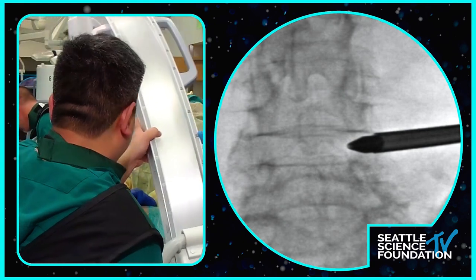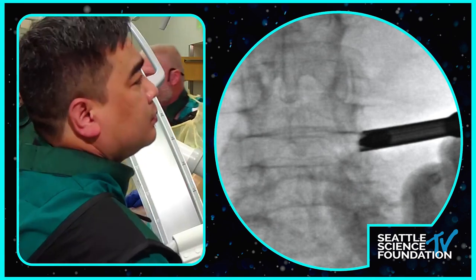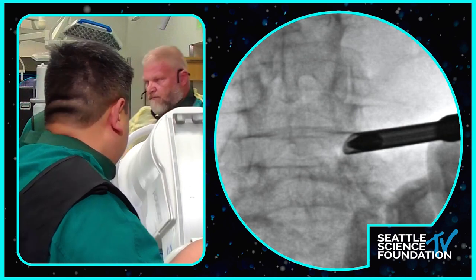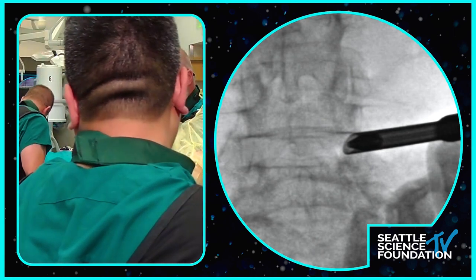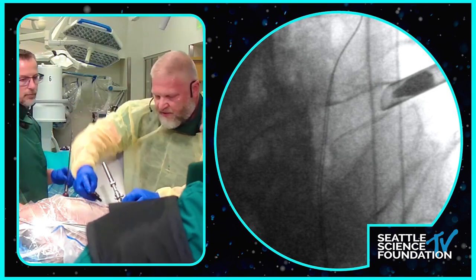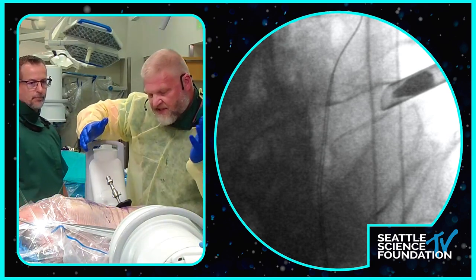Oh wait, one more shot. It moved on me. Yeah, great. Lost the spot. Shot there. There we go. Let's go lateral. And then we'll use the auger and then there we go. So we're just docked in there. We have the little inserter piece. So this system's kind of nice because it's got a stop that kind of holds you.